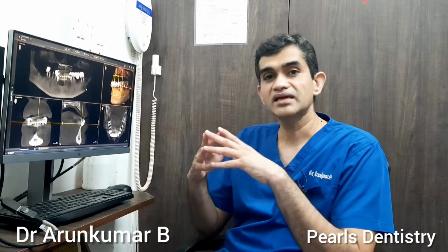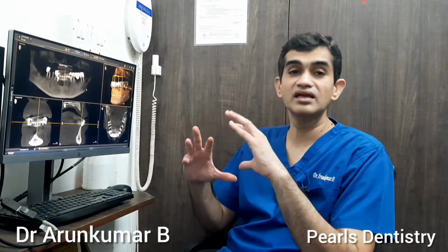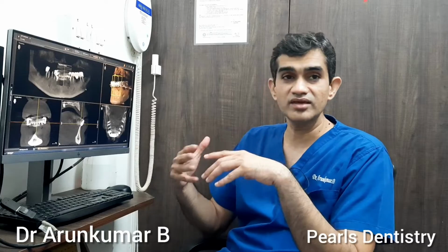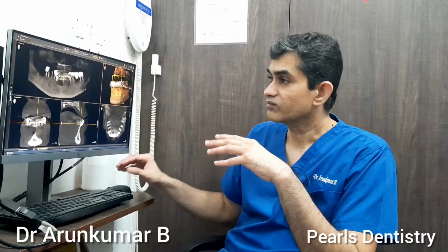When it comes to placing dental implants, we always take an X-ray before we actually start the process. Mostly, an X-ray shows only limited information. So when we do implants, my always go-to diagnostic aid is to take what is called a cone beam CT or a CBCT.